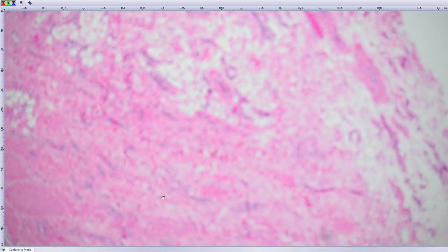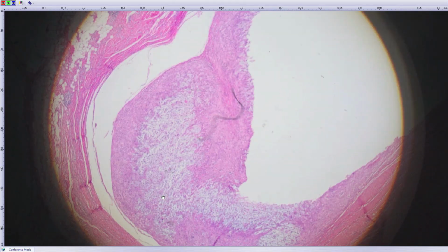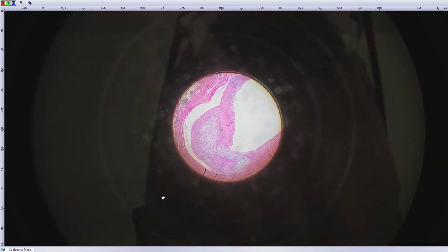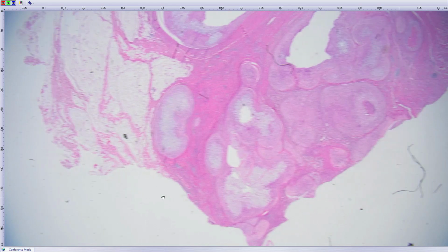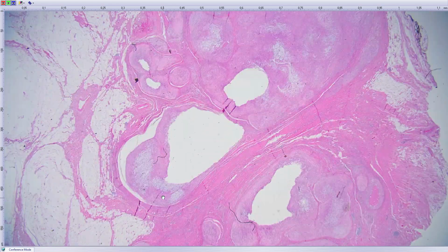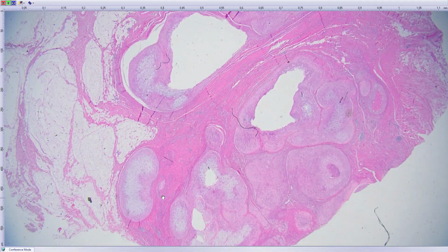Here, soft tissue lesions of 6 centimeters, that was at gluteal region. Maybe even smaller. And it is so nicely lobularly arranged. You can see the nodular arrangement. And the centers of these nodules are necrotic.